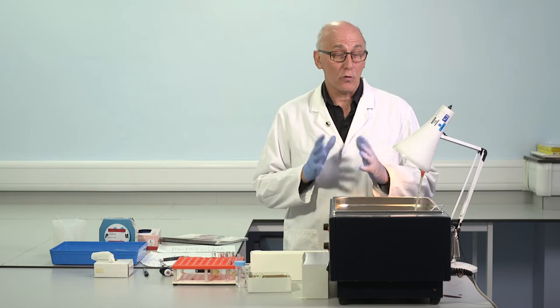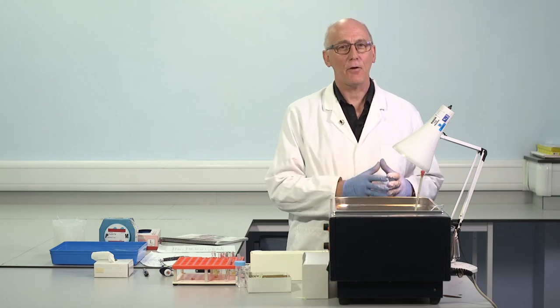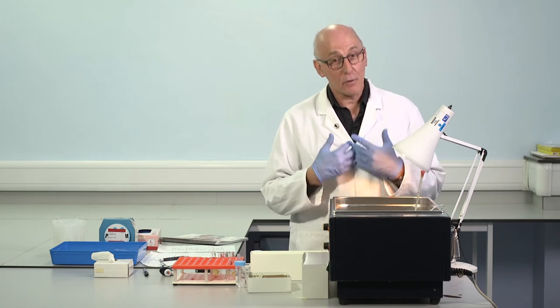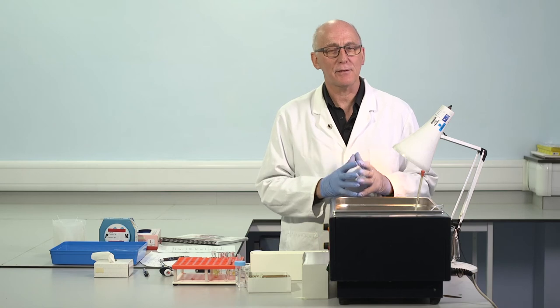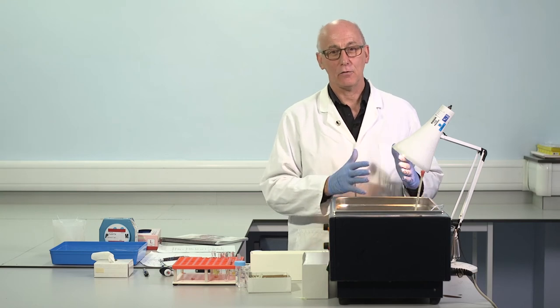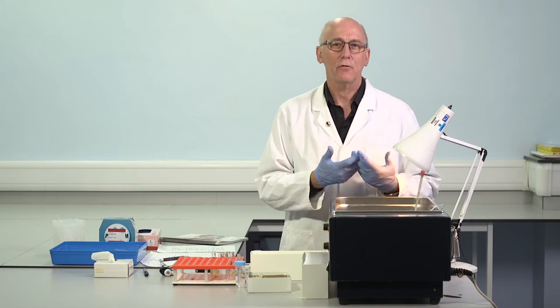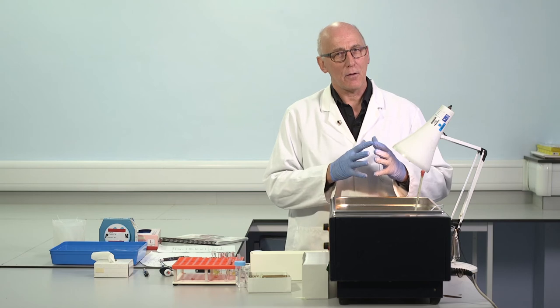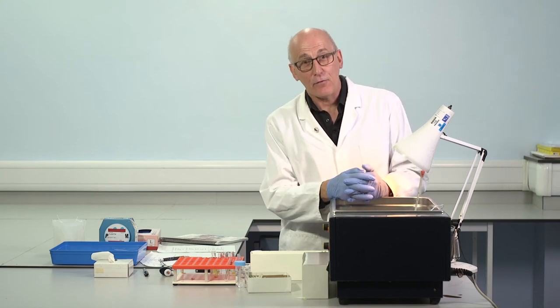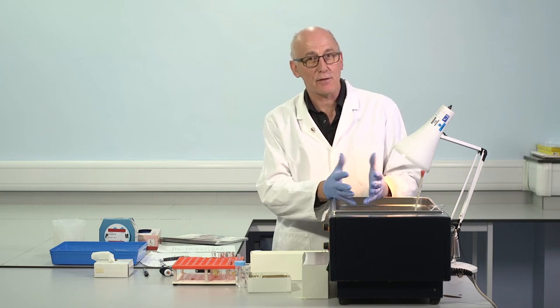The factor VIII inhibitor assay, also described in the WFH laboratory manual, as you'll be aware, involves a 2 hour incubation. In my own centre, if there is a possibility of an inhibitor present, we prefer to make that specific factor VIII inhibitor assay using those same 2 hours, rather than using them to make some APTT mixtures and draw some possible conclusions that may well lead us to do the factor VIII inhibitor assay anyway. I prefer to use that 2 hours on the specific test. The information is much safer in terms of interpretation.